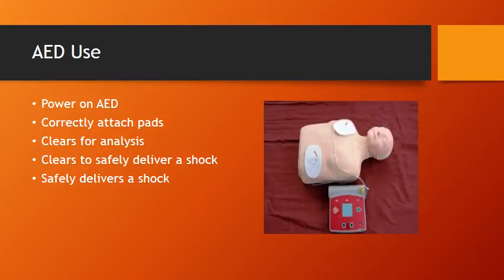Communicate clearly to all other rescuers to stop touching the victim, because we want to make sure that we are not shocking anyone but the victim. So clear everyone for safety, then deliver the shock. Once the shock is delivered, you will immediately resume the chest compressions.